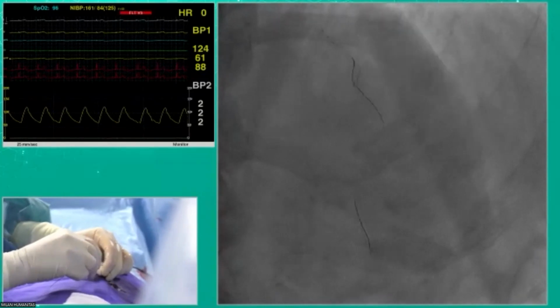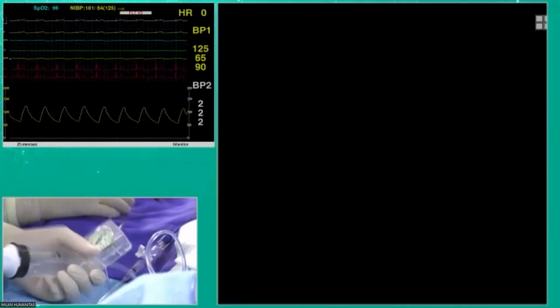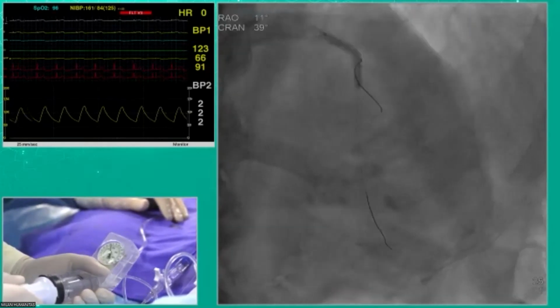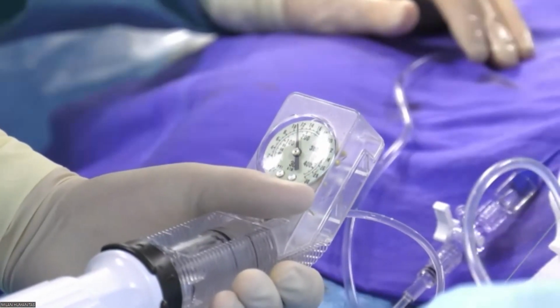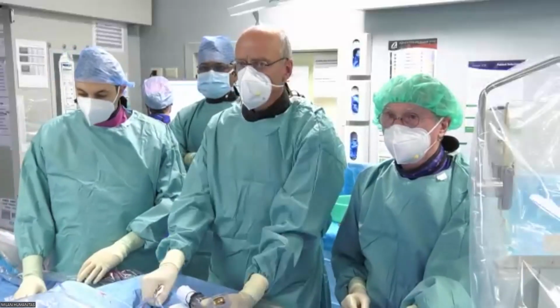Okay, perfect. So we have the options of a drug-coated balloon, a bioresorbable vascular support. And the issue is, in case DCB causes an issue and we have to go with the DES after that, the cost factor comes in a lot. Otherwise, DCB looks very promising. Smaller vessels, distal vessels, we predominantly go with them. Otherwise, BRS in the proximal vessels.